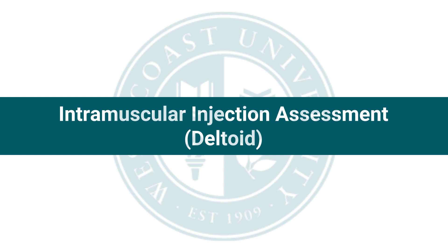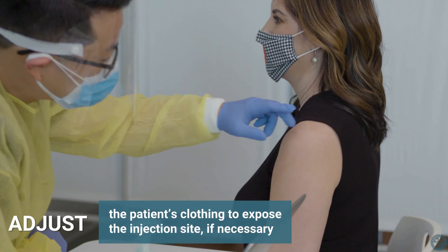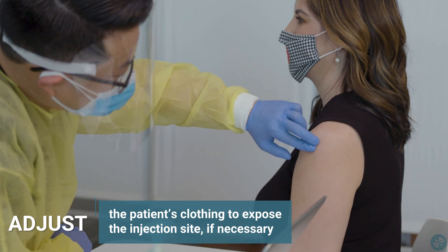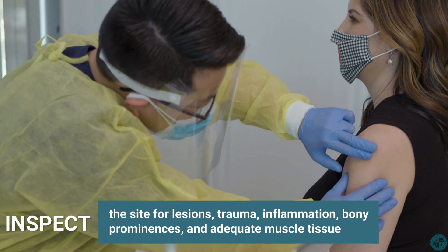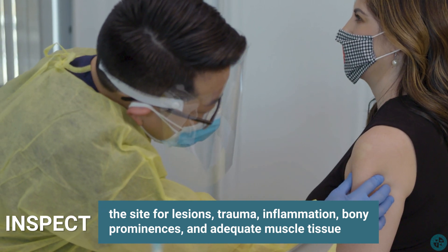Intramuscular injection assessment – deltoid. If necessary, adjust the patient's clothing to expose the injection site. Inspect the site for lesions, trauma, inflammation, bony prominences, and adequate muscle tissue.